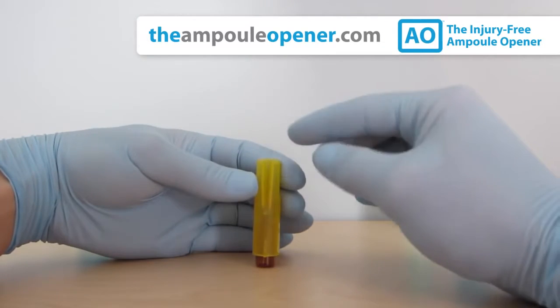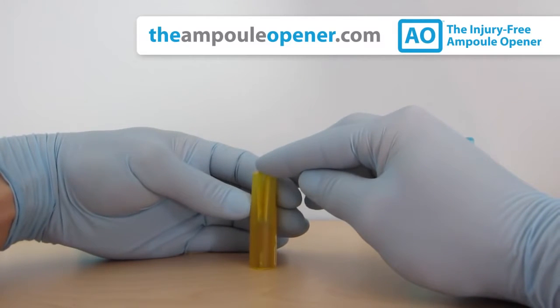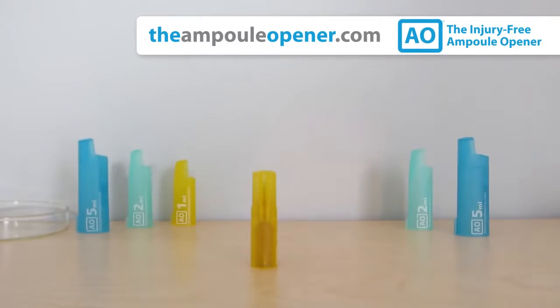When you encounter resistance and the ampule is nearly covered, press down like a button. You'll hear a click sound as the AO opens the ampule.